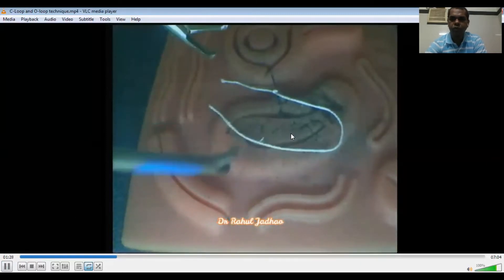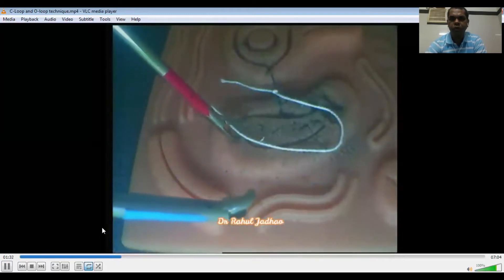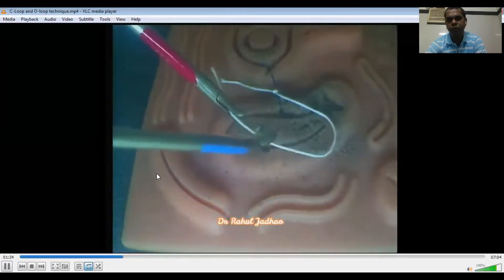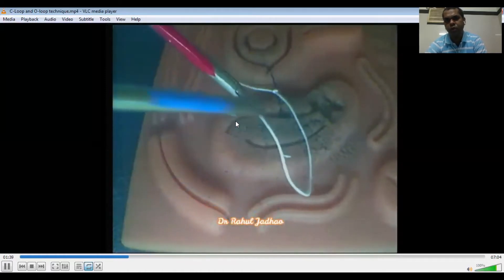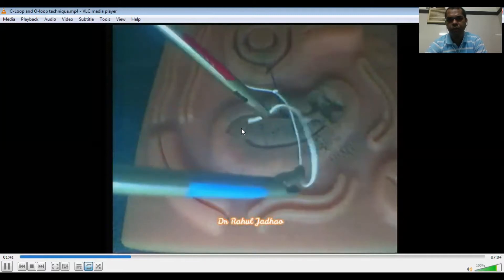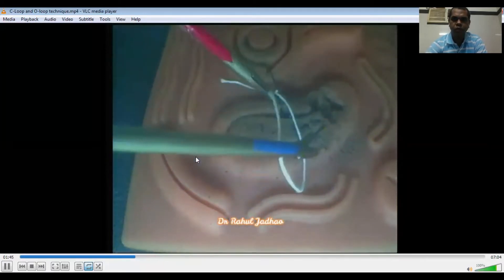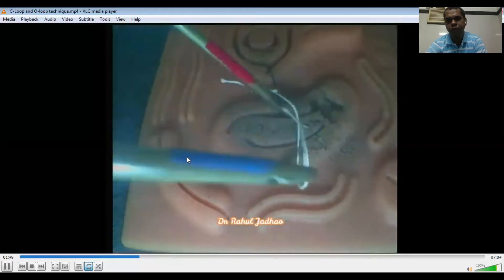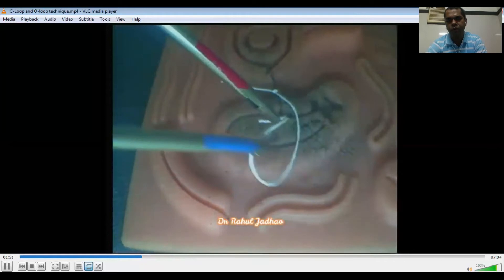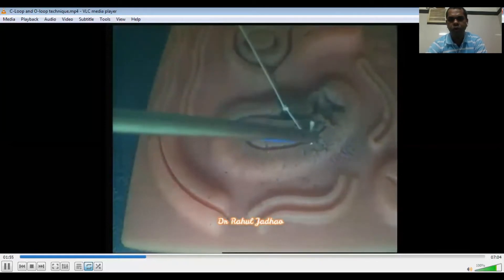Now the C-loop is facing towards the left. Again the left needle holder — we will supinate the left hand like this. And now after supinating it will become passive. Then the right needle holder squeezes in and a loop is made. Right needle holder squeezes in, loop is made. Now both the threads are pulled to the opposite side.